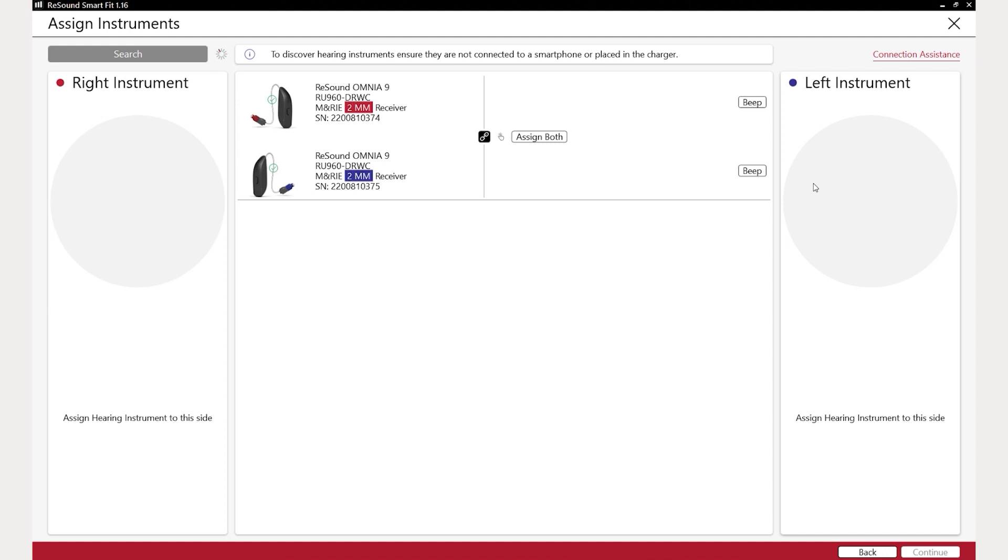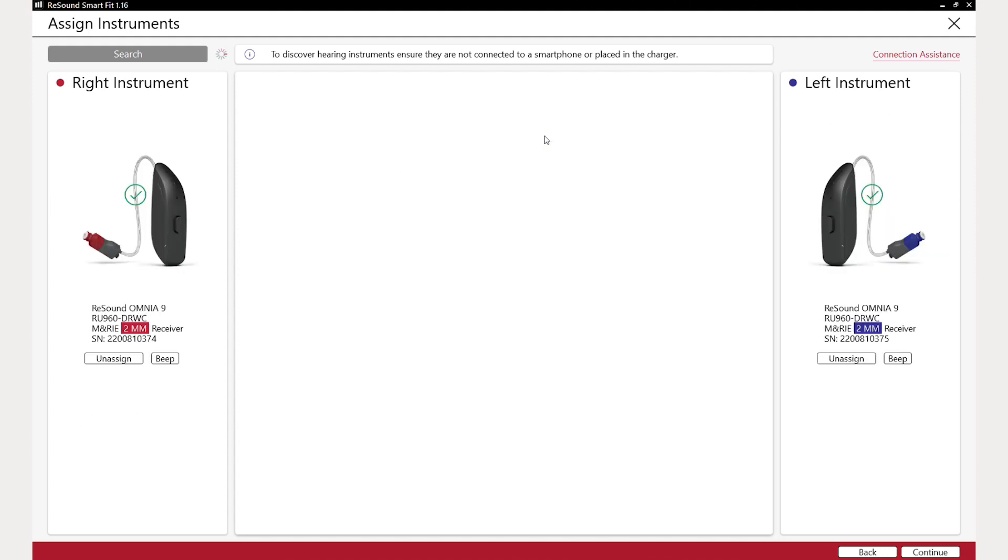Identify the correct hearing aids on the list and assign both devices, or just press the button on the hearing aids to assign them to the fitting. The software will connect to the hearing aids and prepare for fitting.